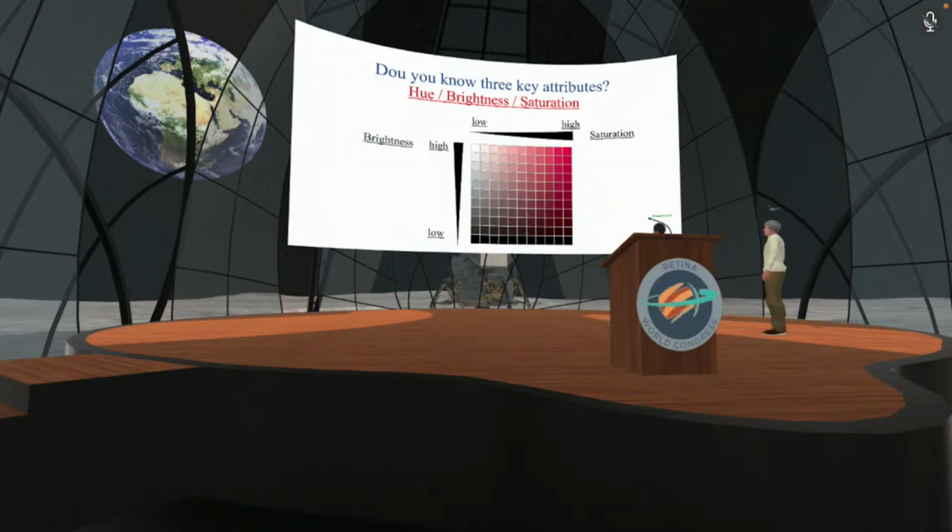So even if the image already has enough difference of brightness and it is highly visible, the visibility can be improved by reducing the saturation and converting it to a grayscale image. Next, please.